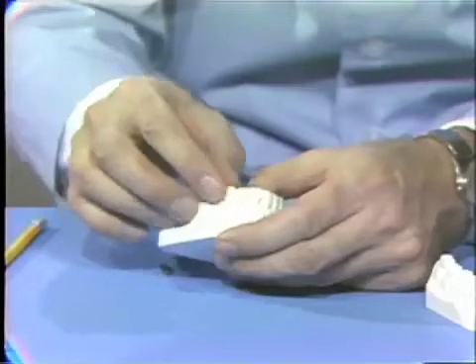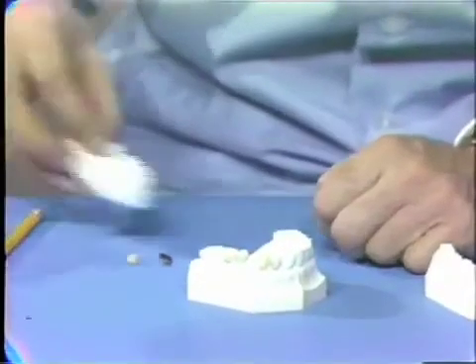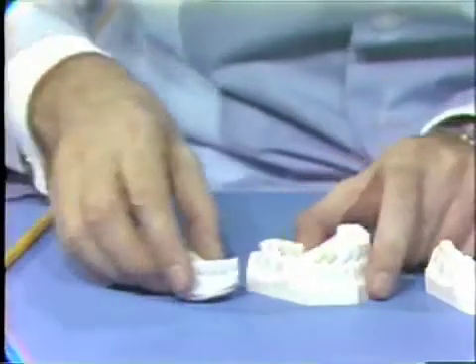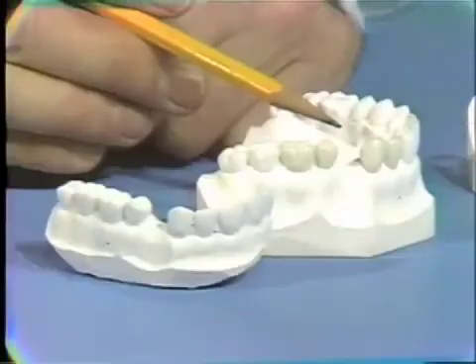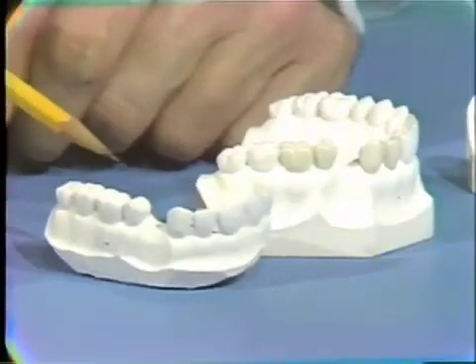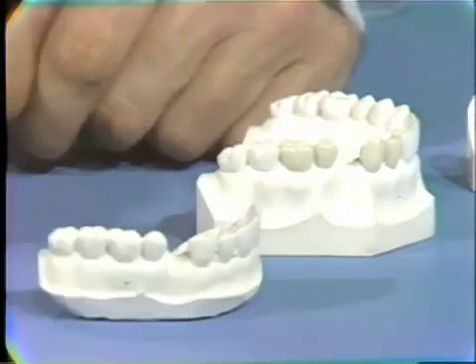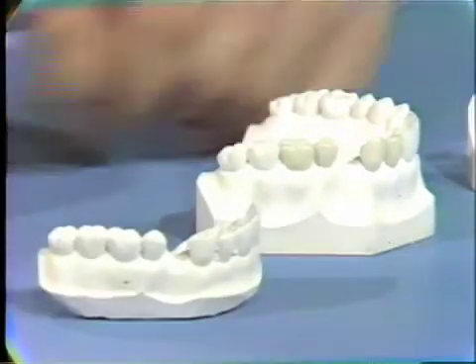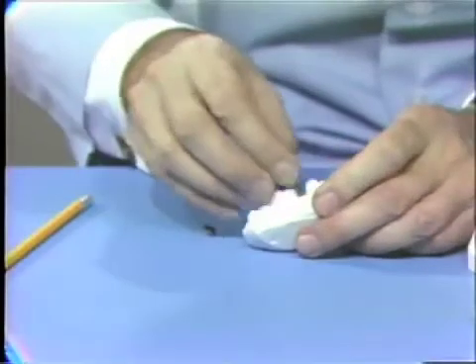Now, in doing the test bridge situation, you want to keep this model clean and free from any contamination. So it's quite a convenient thing to take an alginate impression of the master model and pour this up in a suitable stone. This is white stone. This model can then be used during the grinding and adaptation of this facing, so this one is kept quite clean and undamaged.